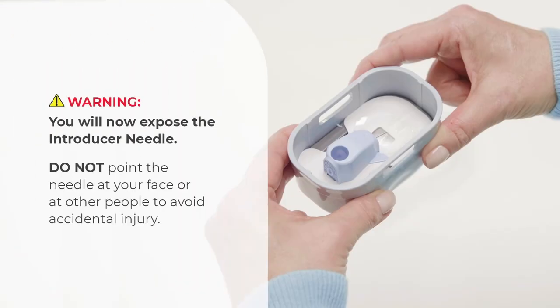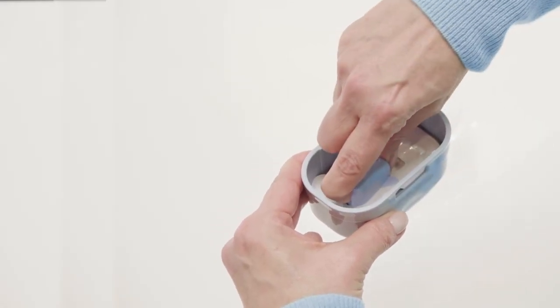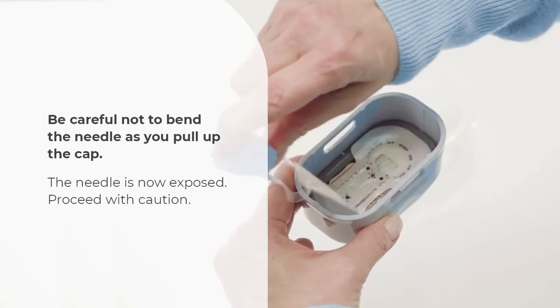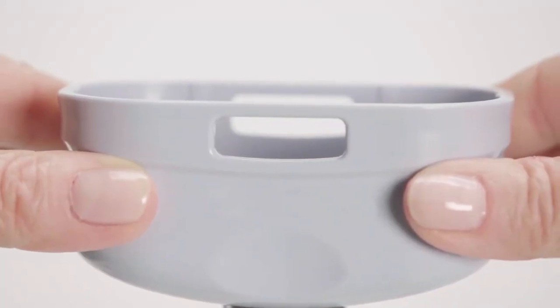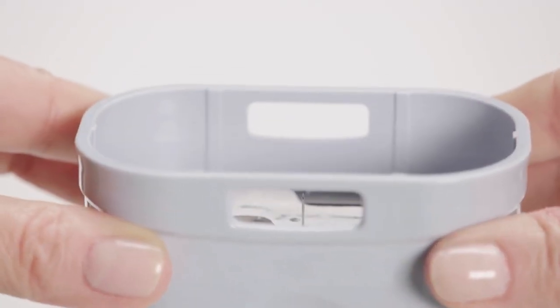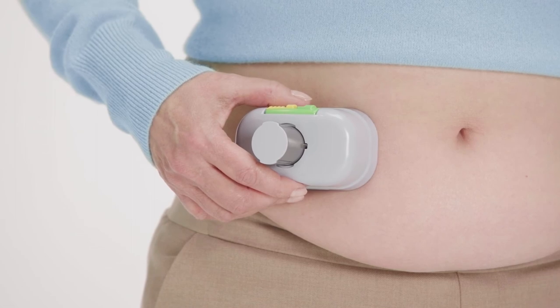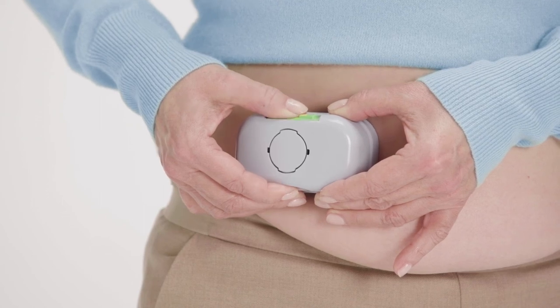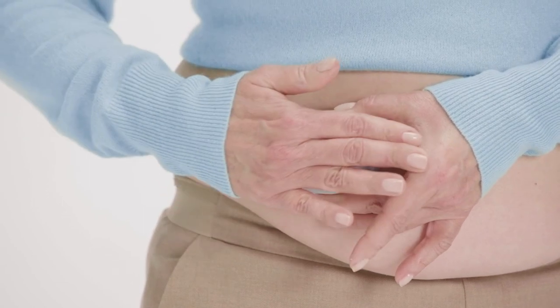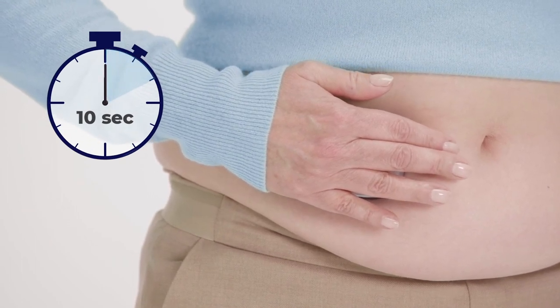You will now expose the introducer needle. Do not point the needle at your face or at other people to avoid accidental injury. Squeeze the grips at both ends of the blue cap and carefully begin to pull the cap straight up and out of the inserter. Be careful not to bend the needle as you pull up the cap. Continue until the liners are removed and the adhesive is fully exposed. Check that the needle is straight and not bent. Now place the inserter with the patch firmly against your prepared site. Then slide the yellow safety and press the green button down to place the patch on your body. Press down on the raised cylinder firmly with the palm of your hand for 10 seconds. Then lift the inserter away.